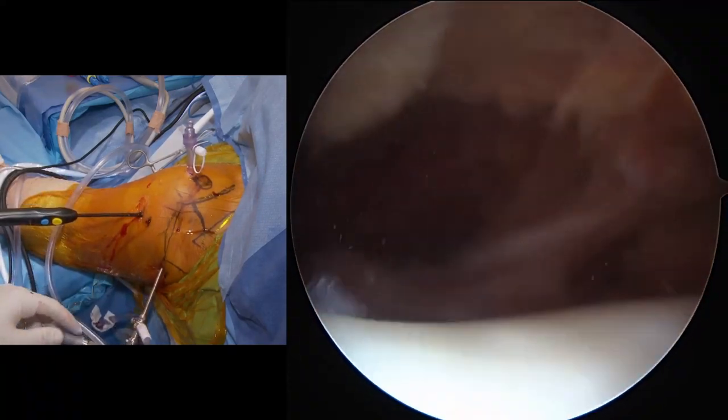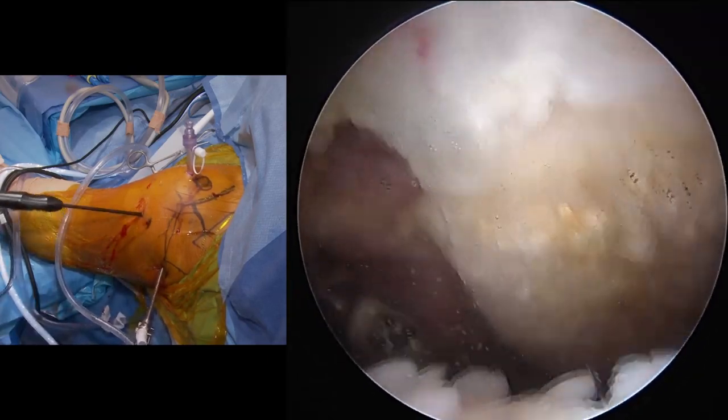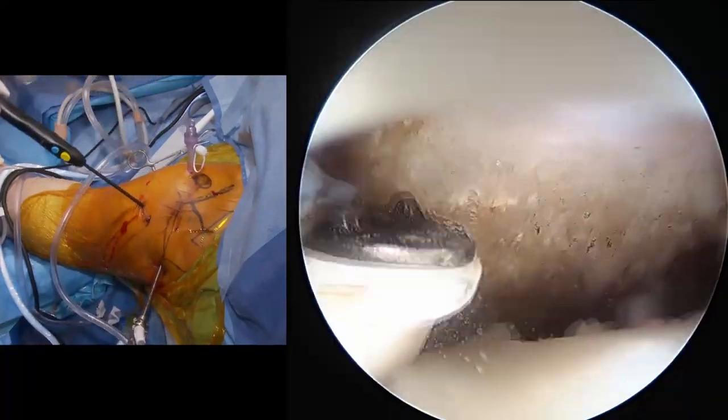Okay. That's going to be interesting. See how that all turns out. We'll get to that in a minute. Keep cleaning up here. And do you have a burr ready? Let's go ahead and get that loaded up.